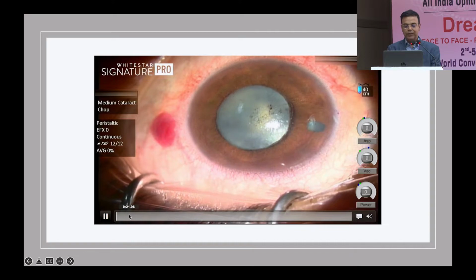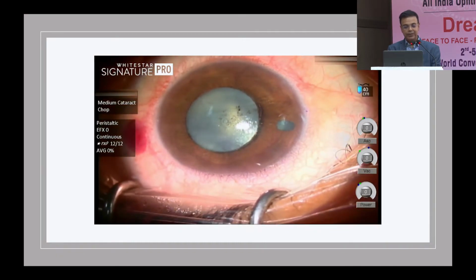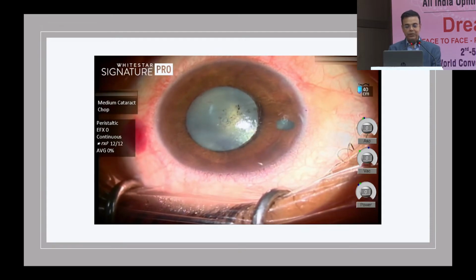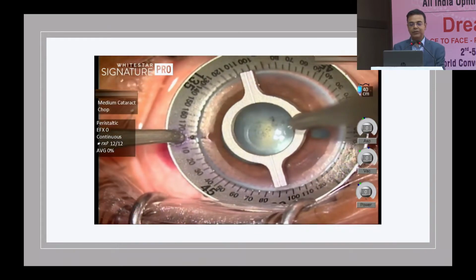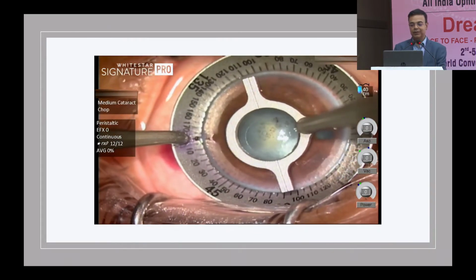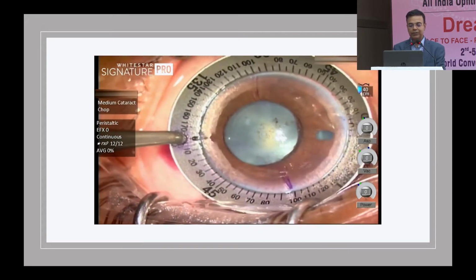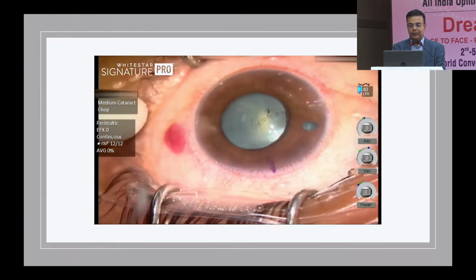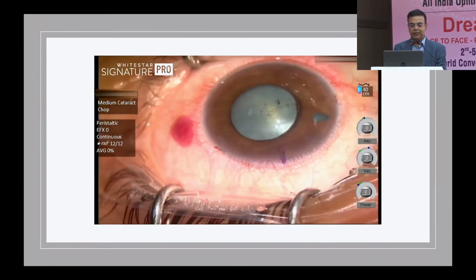So as we went ahead with the cataract surgery, we had to first obviously remove the ICL and then stain the capsule, and I find it difficult sometimes to have viscoelastic in the eye. This lady also had high astigmatism. She had a toric ICL, so we wanted to correct with a toric lens if possible. So I decided to first explant the lens without using viscoelastic, under infusion.